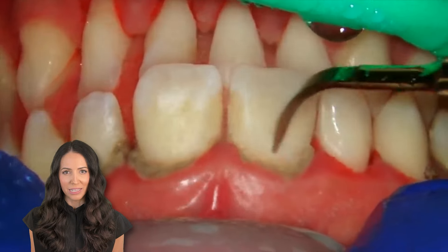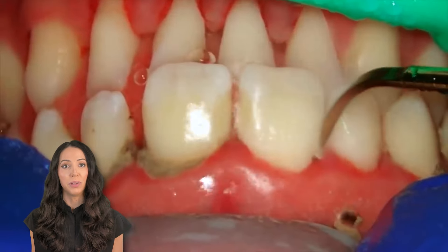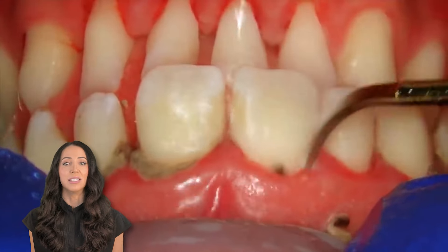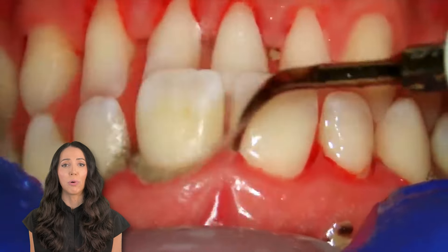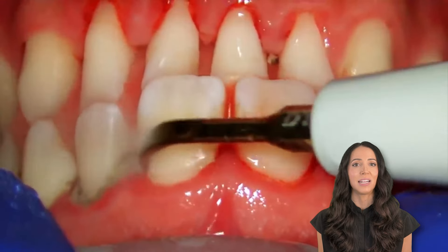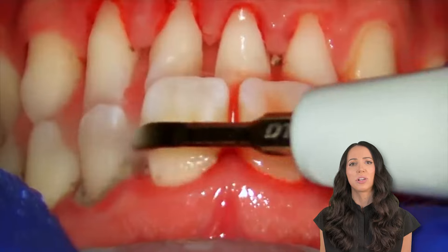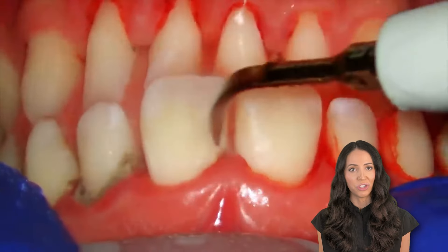You can really see this calculus here. Another big question patients ask me about this buildup when they see it on their teeth is: how did it get there? The number one reason is usually from poor home care — not keeping them clean enough. So proper brushing techniques and proper flossing techniques, or water flossing or interdental brushes, are critical in preventing this plaque from turning into tartar on your teeth.